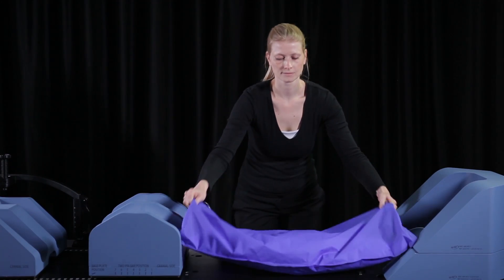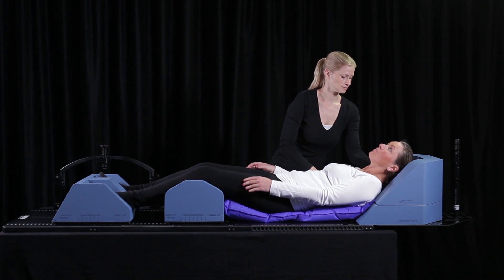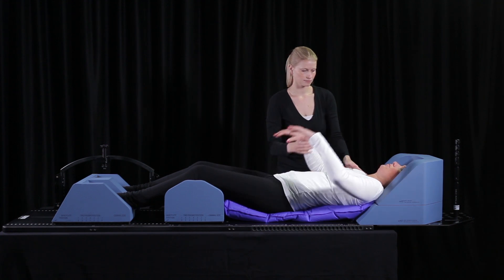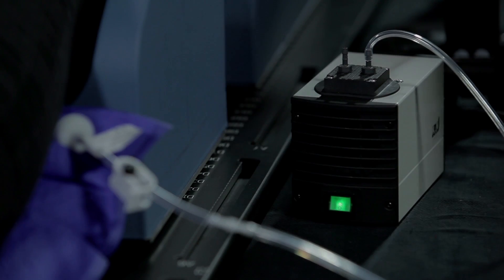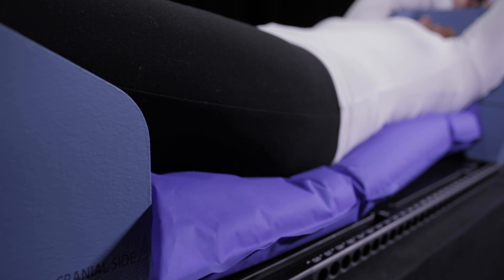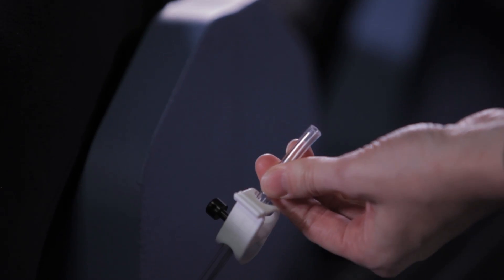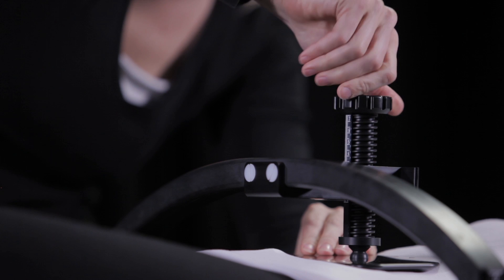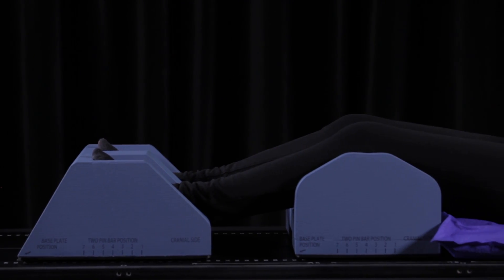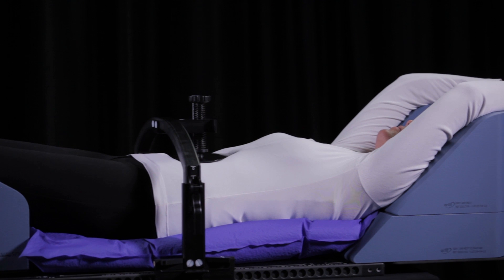Place the vacuum bag on the baseplate, then position the patient on the vacuum bag. Once the patient is in the correct position, attach the bag to the vacuum pump and switch on the pump to deflate the bag. Deflate the bag for a minimum of three minutes in order to keep the desired shape during six weeks. Once the air has been evacuated, close the bag with the white clamp attached to the vacuum tube and insert the black sealing pin in the vacuum tube. The arch and pressure plate of the mechanical pressure system can now be attached to the baseplate, then turn down the screw until you've reached the desired abdominal pressure.